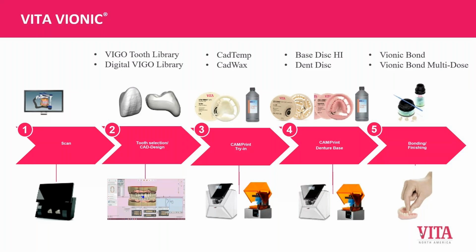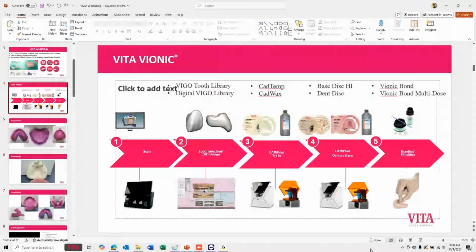The next piece of this is the tooth library. So before we move on, I'm going to jump over to another slide and show you how to get the library.